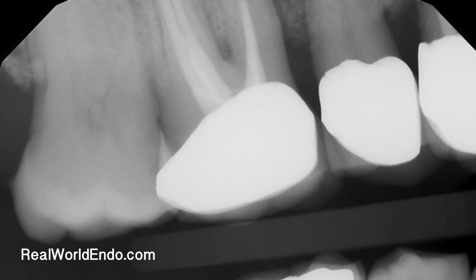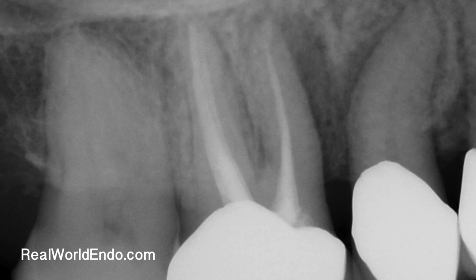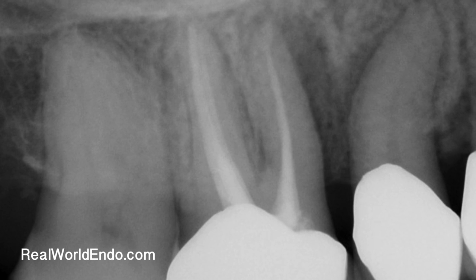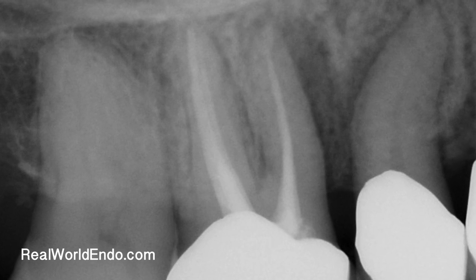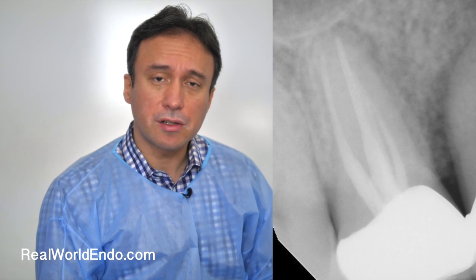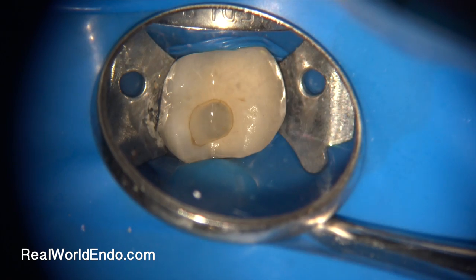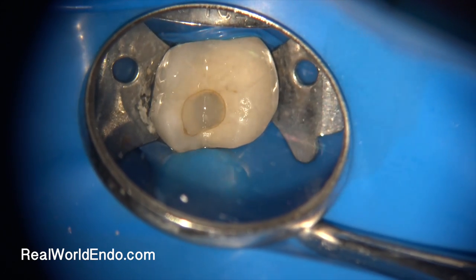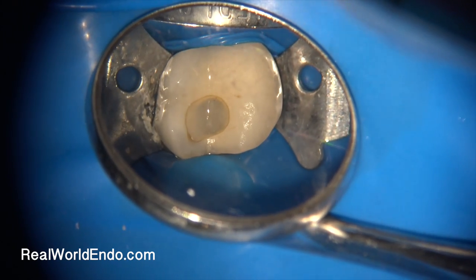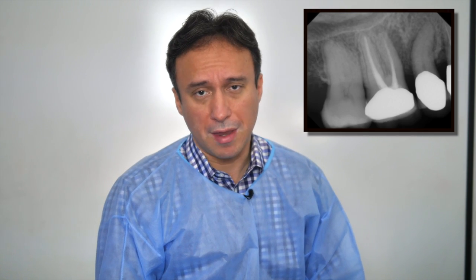This maxillary molar was referred for a consultation, and a previous root canal therapy with a lateral radiolucency was present around the mesial root. This patient recalls that the RCT was done around 10 years ago through a crown, and that the access was now filled with a composite filling. The tooth was clinically asymptomatic, but the patient recalls a history of symptoms to chewing around the tooth.